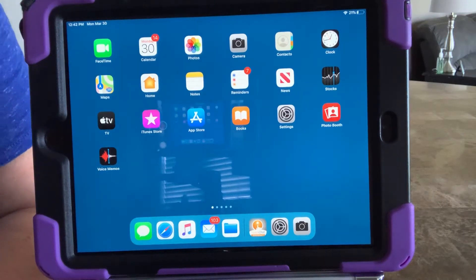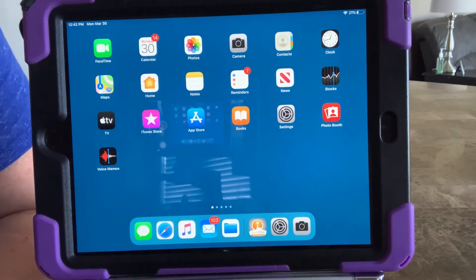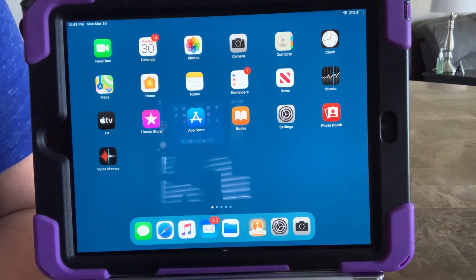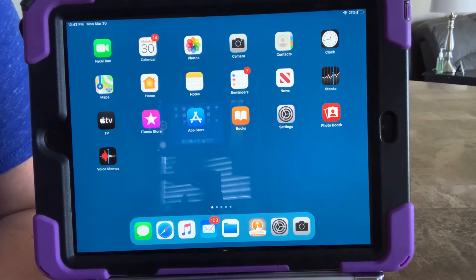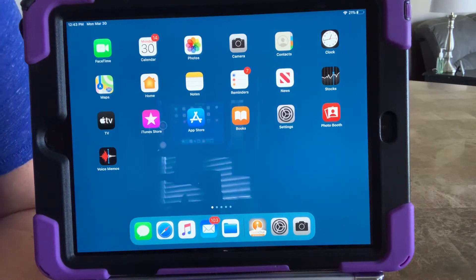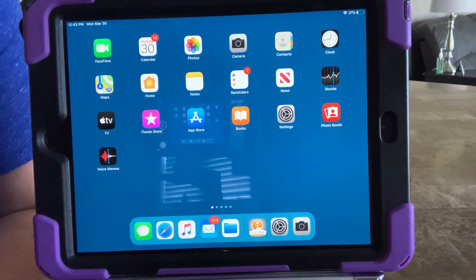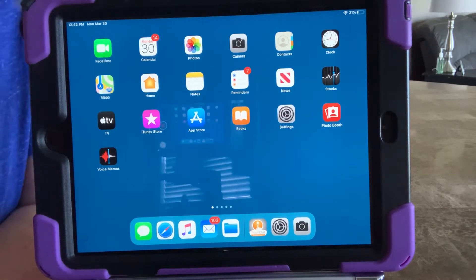Hey everyone! Today we're going to talk about using guided access with your communication app on your iPad. This is a common problem with students who are trying to use AAC on their iPad only, meaning we're trying to use it as a dedicated device even though it's not. Guided access is a way that we can keep our students in the communication app at all times.